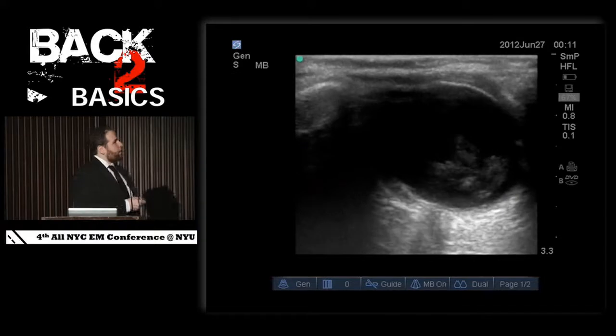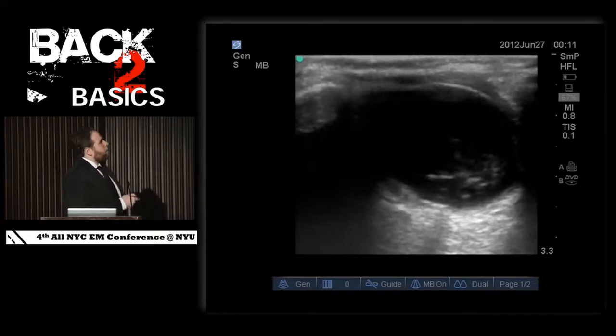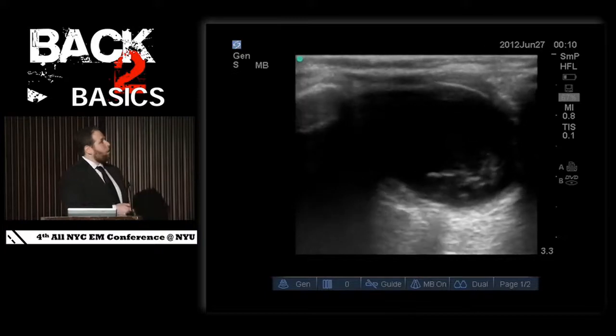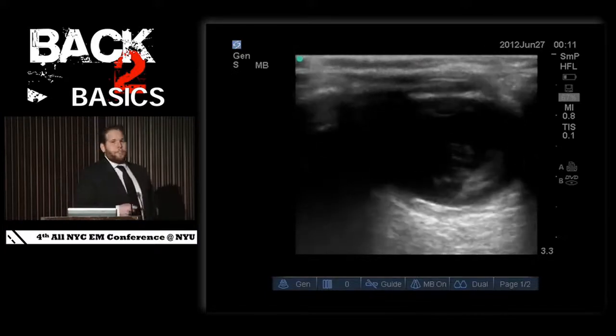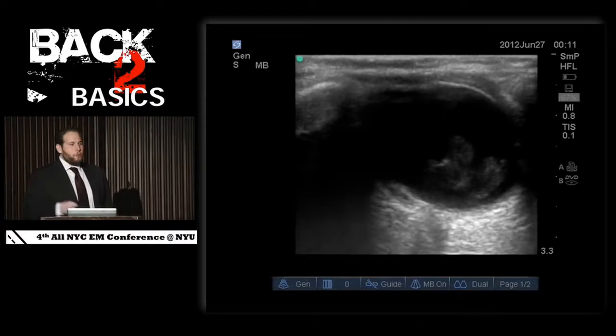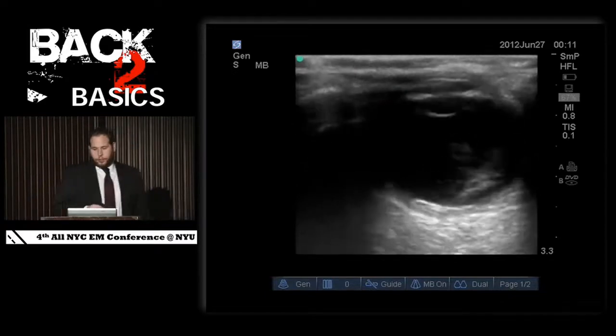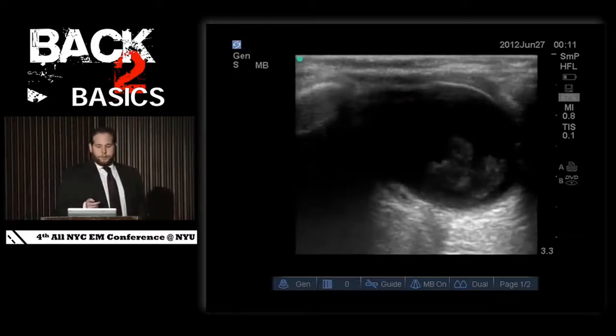So it looks kind of like a vitreous hemorrhage if you think about it. And once again, you can see that lens pop in there, and here's your optic nerve popping in and out. But here's your vitreous hemorrhage. So far we've had two pathologies that are pretty easily visible on the ultrasounds. So let's move on to the next patient.